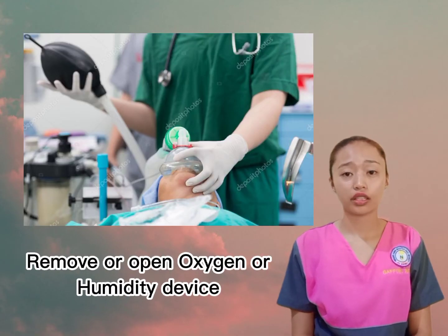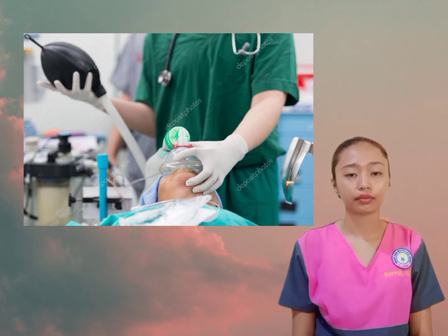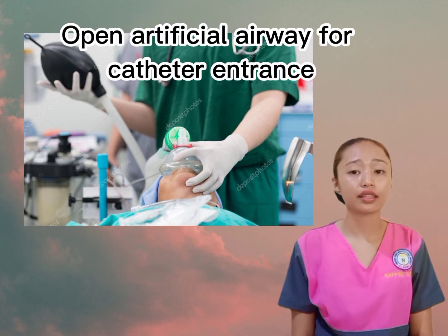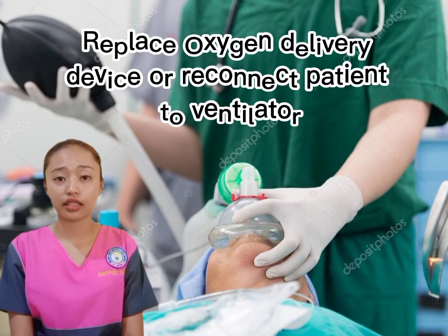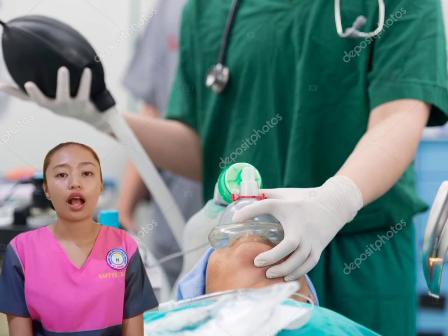Remove or open the oxygen or humidity device to the patient with the non-dominant hand. This opens the artificial airway for catheter entrance. Have a second person assist when indicated to avoid unintentional extubation. Replace the oxygen delivery device or reconnect the patient to the ventilator.